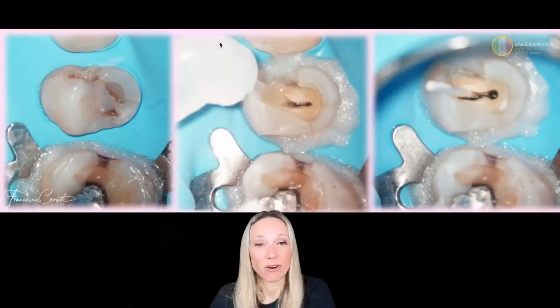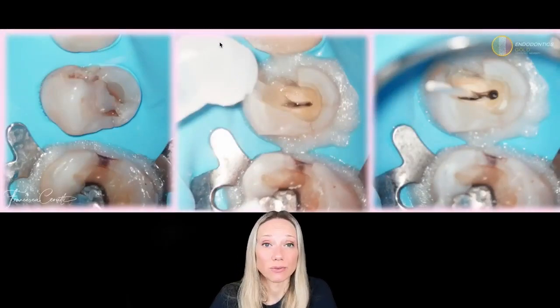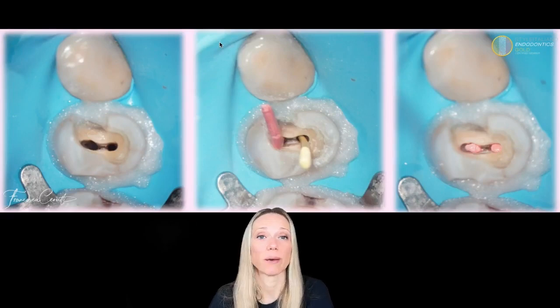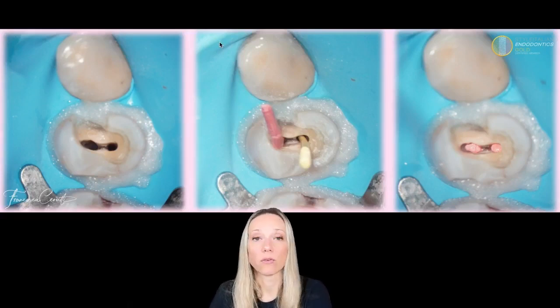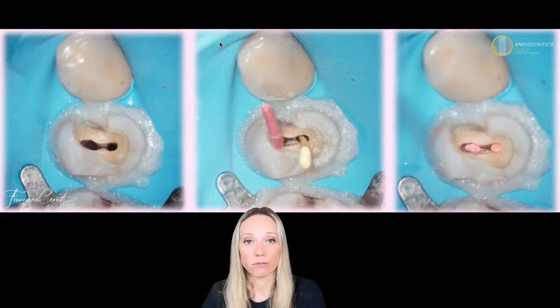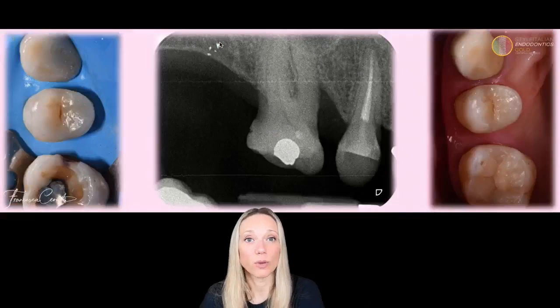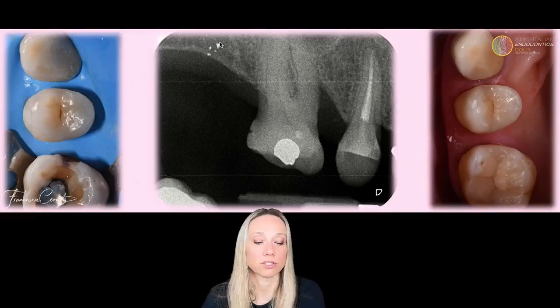Another case of a regular tooth. There is a confluence of the root canals in this case. So what you're going to do, how are you going to modify your sequence? You're just remembering to drive to the working length only one file. You choose the root canal in which it's easier for you to reach the working length, and that is the canal that you're going to shape up to the working length. And the other one, the confluent, you're going to shape it just up to the confluence. In this case, you reduce the risk of breaking files, you reduce operative times, and you reduce the loss of dentine for the patient. So it's a win-win situation. And I do the post-endodontic restoration, I do also the restoration of the first molar, and it's easy.